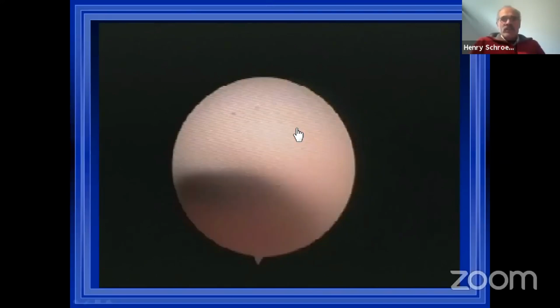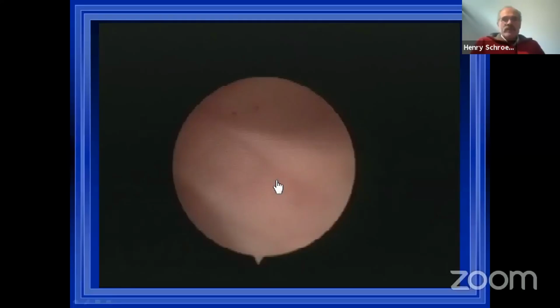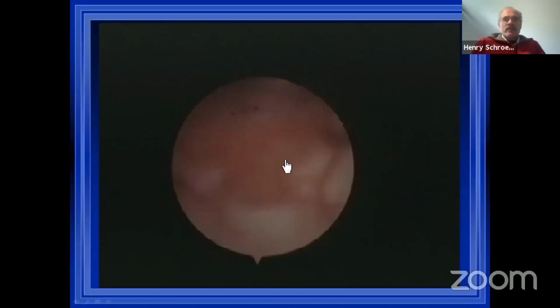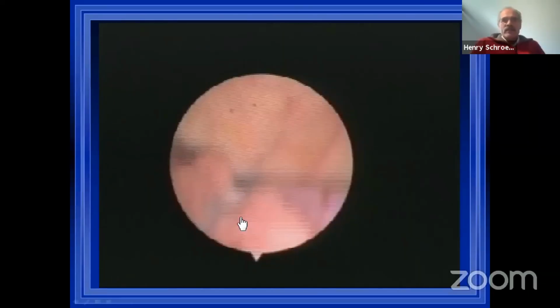This is an old video. You see this an old fiberscope, what we used at that time in the isolated fourth ventricle. We go in. See, this is the vermis. And then you simply look for the choroid plexus, and when you follow the choroid plexus, it guides you to the foramen of Luschka. But you see the optical quality is not so good. Here's Magendie. It's completely occluded. This is the rhomboid fossa, and here completely occluded foramen Magendie in the midline.